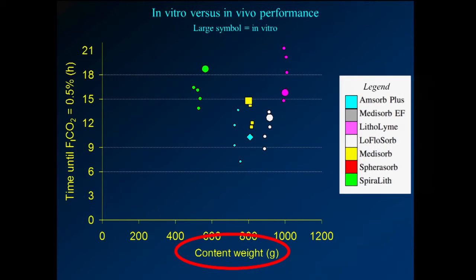And I'm going to add the in vitro results here, because remember the question I had was, can I use my in vitro data to do some modeling? Do they really represent what's happening in vivo? And what we found was that basically these in vitro results seem to represent reasonably well what's happening in real life.